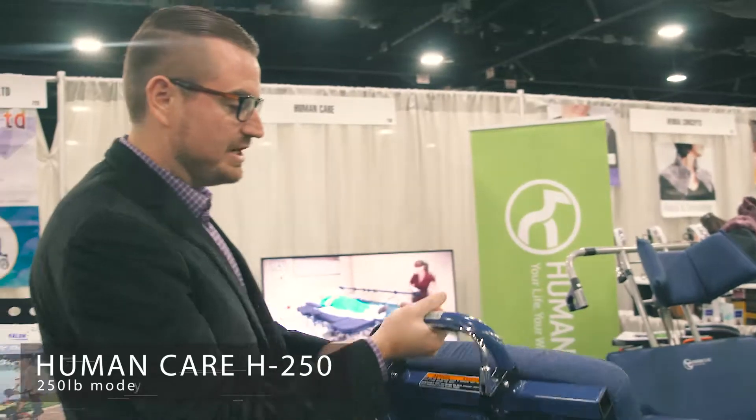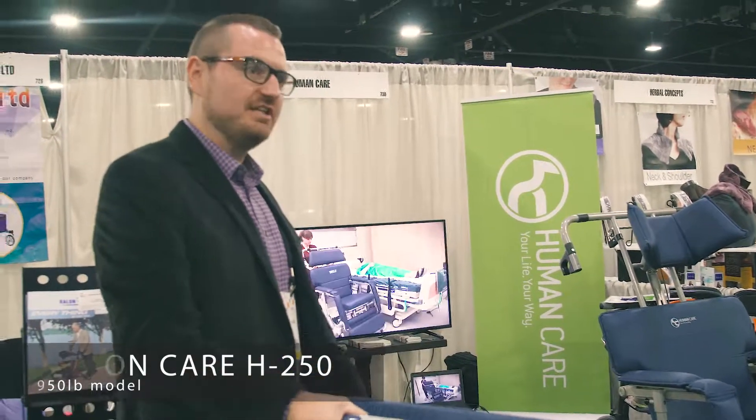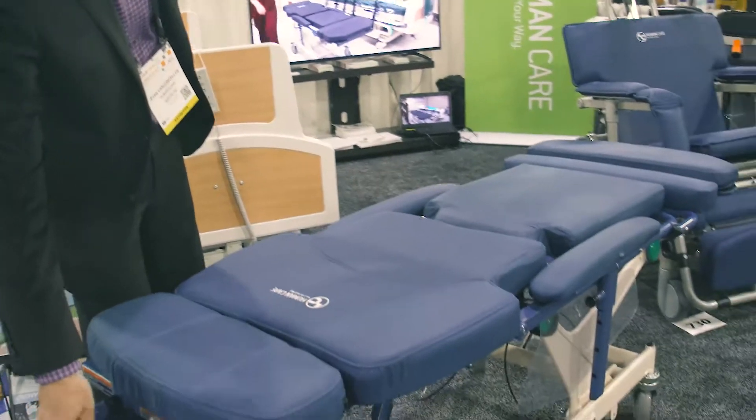This is the recline. Wherever you stop, it stops, so it gives you an infinite number of repositioning options. If a patient says that feels good right there, you stop right there. And it goes all the way into a better stretch position.